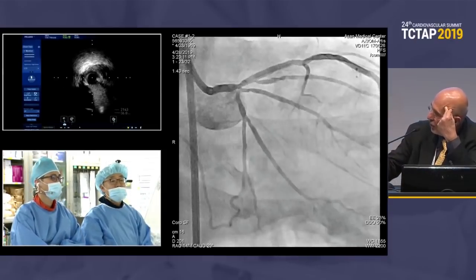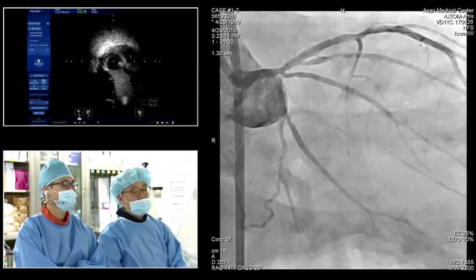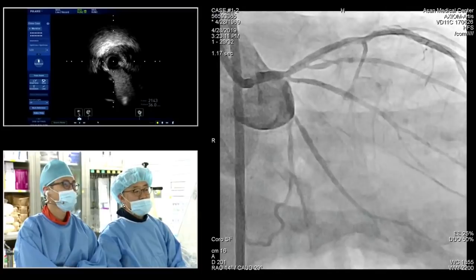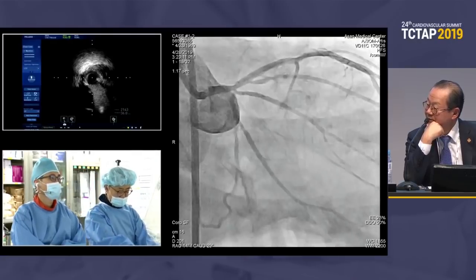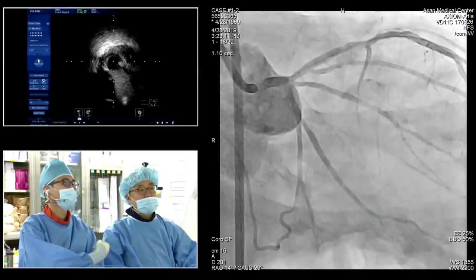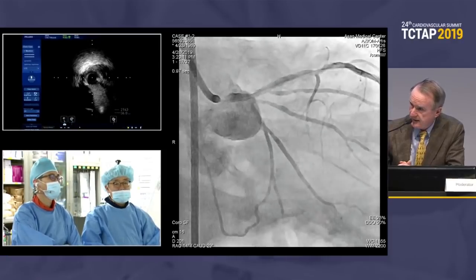I think it is a focal lesion at the ostium, so I'll go for single stenting as well. The plaque of the proximal circumflex is not big enough, so a DEB may be enough to treat the proximal circumflex, with a single stent from left main to proximal LAD. In general, the final decision is always after pre-dilatation, because you may change the decision after pre-dilatation.